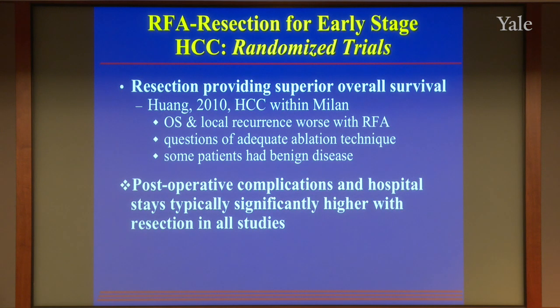This one study showed the resection had superior overall survival. There were some questions about adequate ablative technique in this study, and some patients turned out to have actually benign disease. In all these studies, still, postoperative complications and hospital stays were typically significantly higher with resection in all of them.